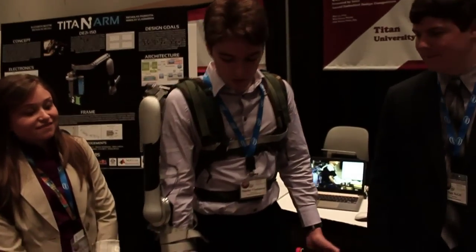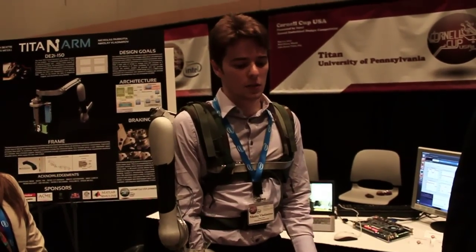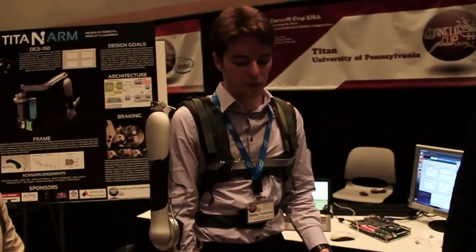The Titan Arm is a powered upper body exoskeleton for use in assisted mobility and also assisted lifting scenarios, as well as some physical therapy applications. For jobs such as warehouse workers or other scenarios where people need to lift a lot of weight, back injuries are extremely prevalent, so we wanted to prevent that and assist people in lifting lots of weight.